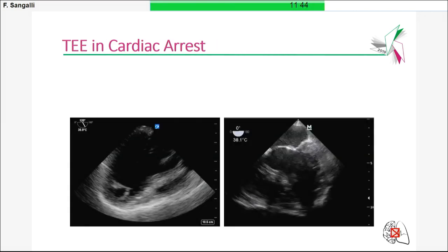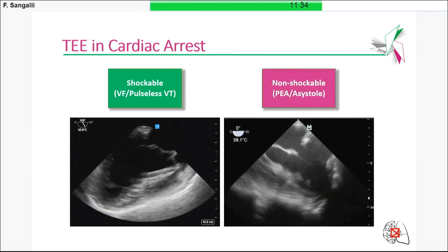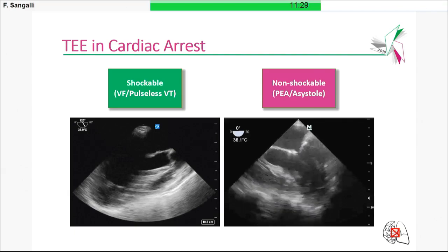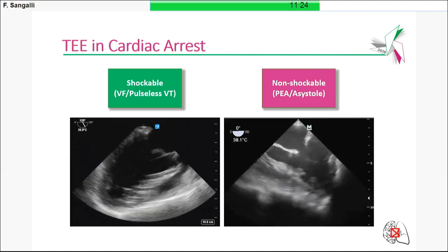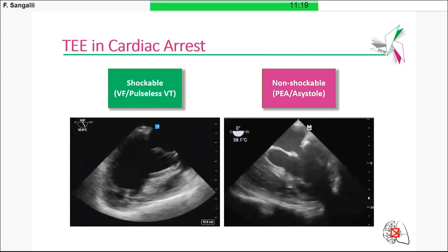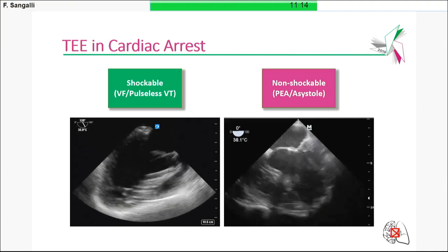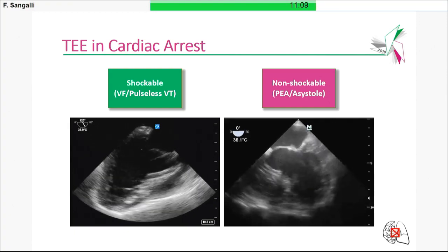And these are, I think, the more common conditions that we face every day in the emergency department or in the general ICU, for instance, in cardiac arrest. We can easily discriminate between cardiac rhythms. I know we have the ECG trace, but if I ask you what cardiac arrest rhythm is this one, I think it will take you 1 to 2 seconds to say that this heart is fibrillating, okay? Same thing for the other one. In case you're wondering, the motion is just CPR being performed.